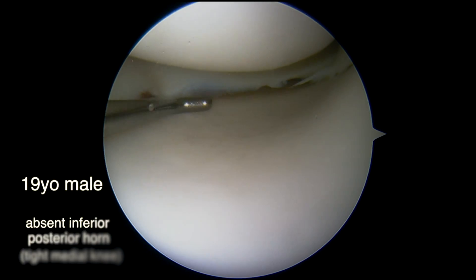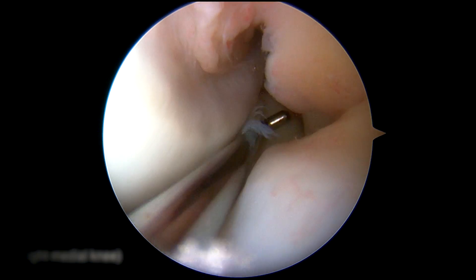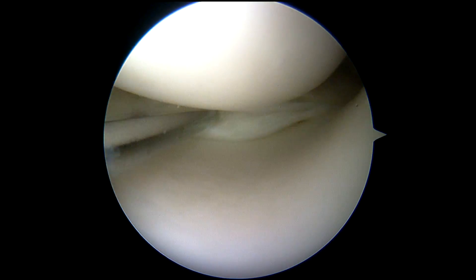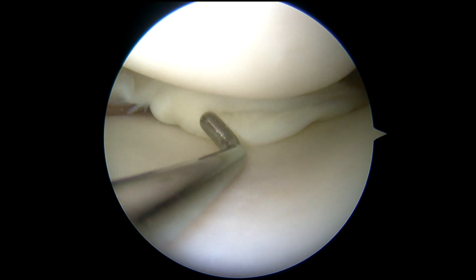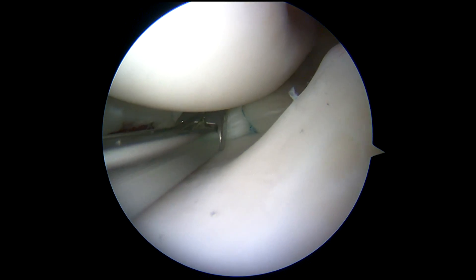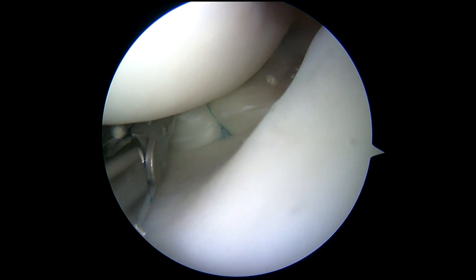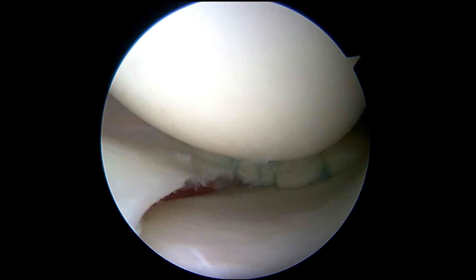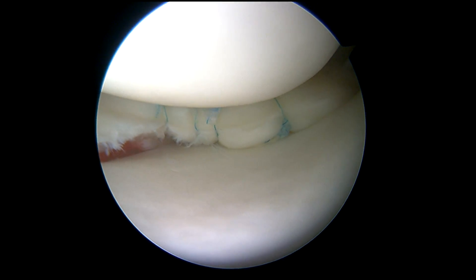The next case is a 19-year-old who was missing the posterior horn of his meniscus, and I found it flipped back in his notch. At the time, I'll admit, I paused and thought to myself, maybe I'm playing it crazy. But in about 20 minutes, I was able to place a few sutures behind his meniscus, and since the meniscus didn't really come to an apex anymore, tie them down in front like a hay bale. The remodeling capacity of a young meniscus surrounded by non-arthritic synovial fluid is actually quite remarkable when the tissues are adequately stabilized and compressed.